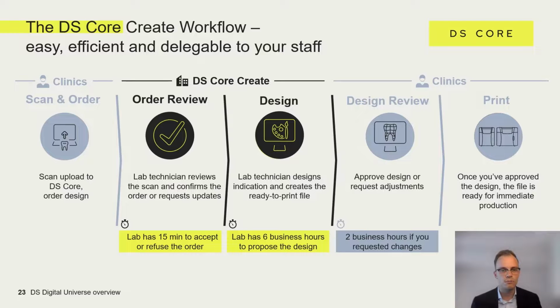The DSCore Create Partner Lab has 15 minutes to accept or to refuse the order, which means in the background a lab technician will review the scan and will confirm whether the scan is good in quality to proceed with the order. Also, the lab will within 6 business hours design the clinical application and provide access to the clinical design for you through the DSCore platform.